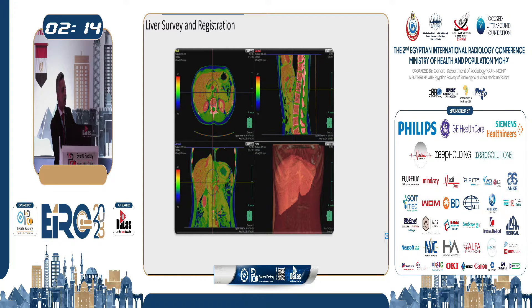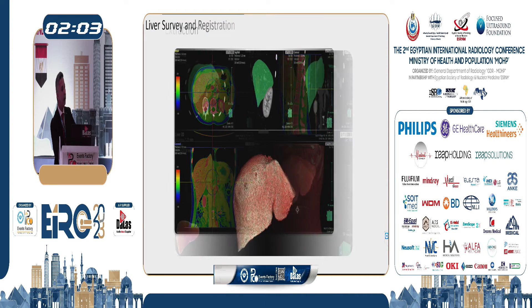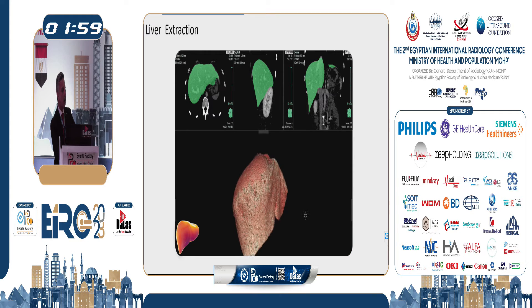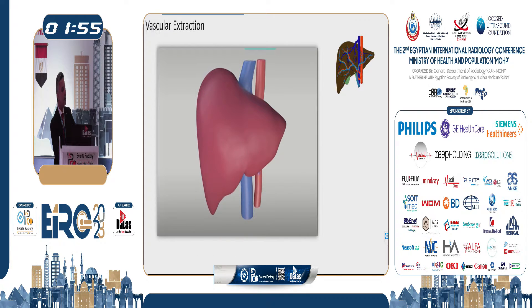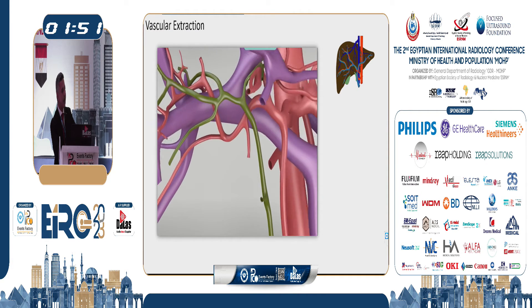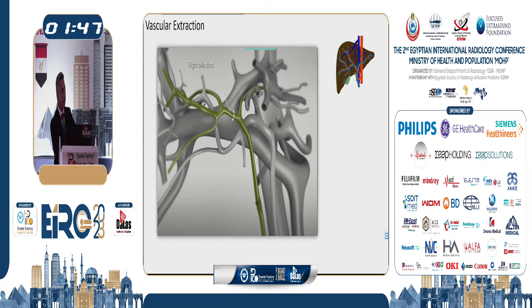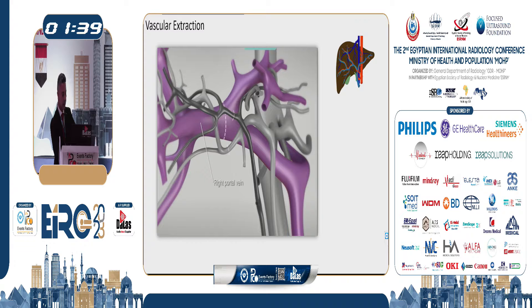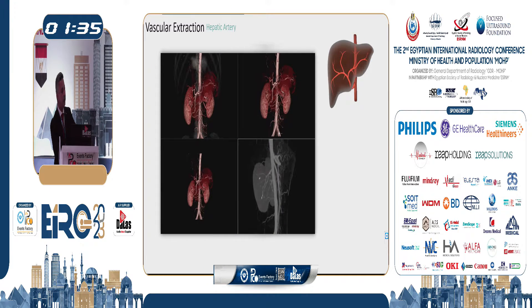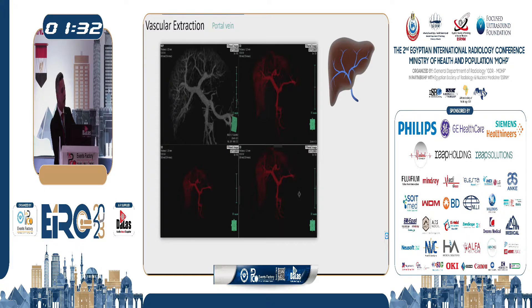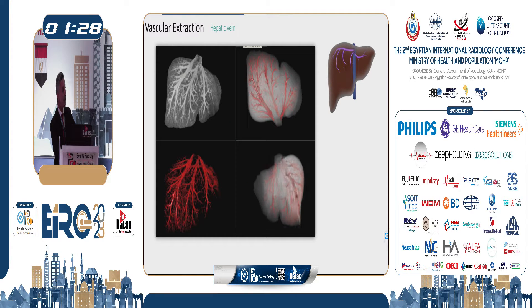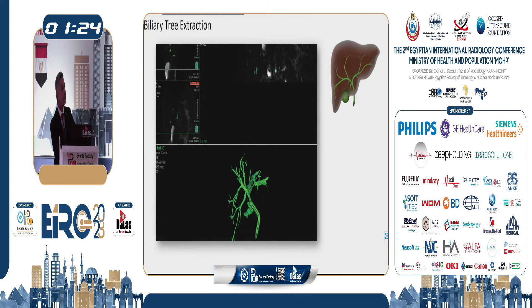Once a CT image is loaded, auto-registration occurs directly, and with one click — based on liver signal intensity and auto-labeling — the system performs complete liver extraction. For vascular extraction, Synapse 3D uses signal intensity differences to extract all liver vasculature including the hepatic artery, hepatic veins, portal vein, and all tributaries. With one click, the hepatic artery and portal vein are extracted. For hepatic veins, the system can also fuse MRI and CT images to extract biliary structures — a process that previously took a very long time with older workstations.